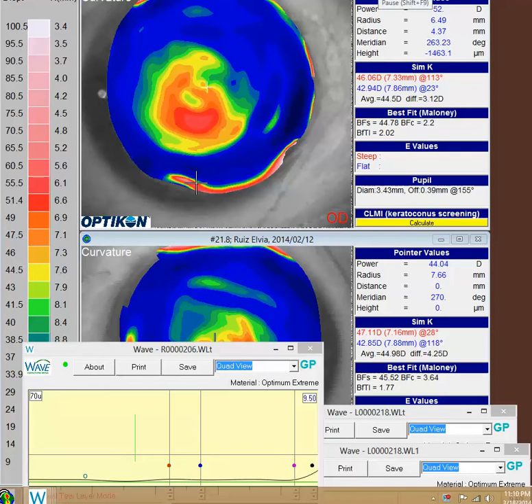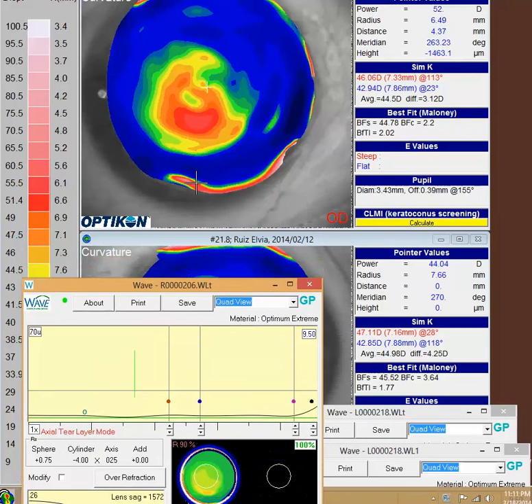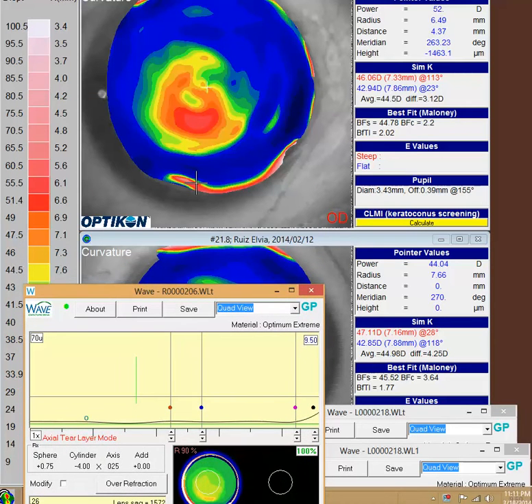I see you're struggling a little bit with your keratoconus patient here, and it looks like you're pretty close on your designs. If we just talk about these for a moment, I do have both designs here. Thanks for sending all the information. If we look here at the right eye, you have a fairly centralized cone.